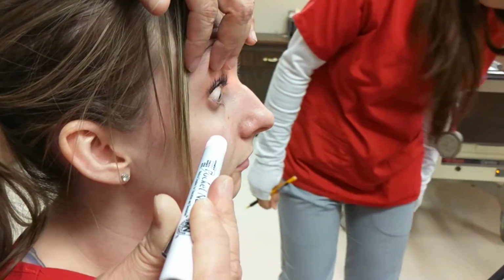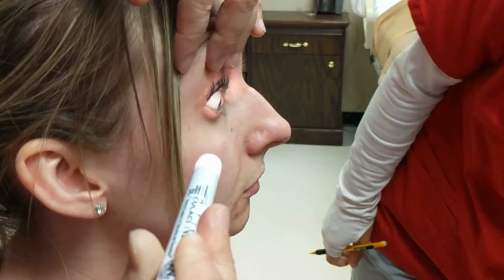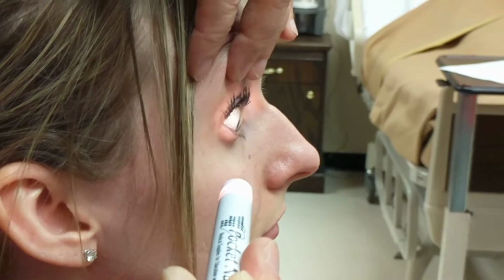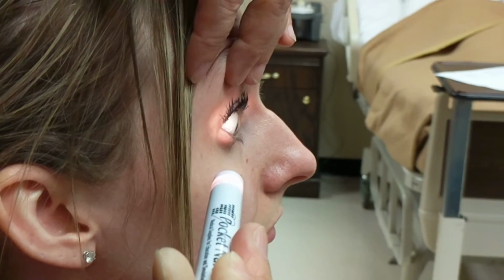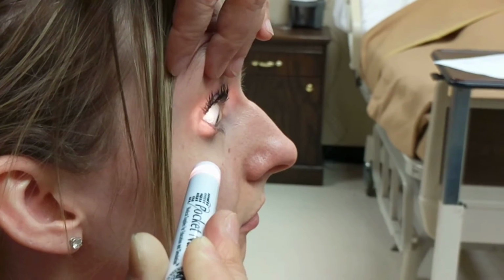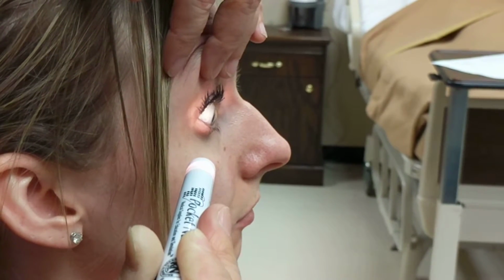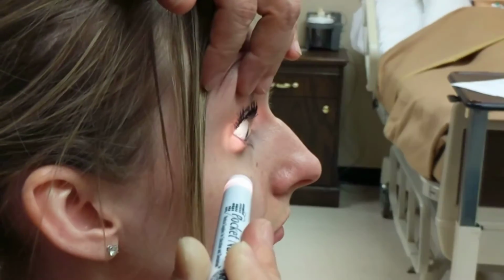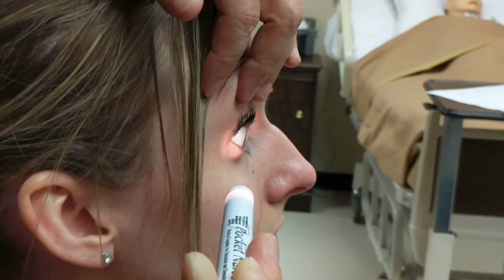Can you see it? Now you have to come to this side because it's going to be hard looking at it from there. You see it? The lens is behind. It's again a transparent layer, behind the iris and pupil.